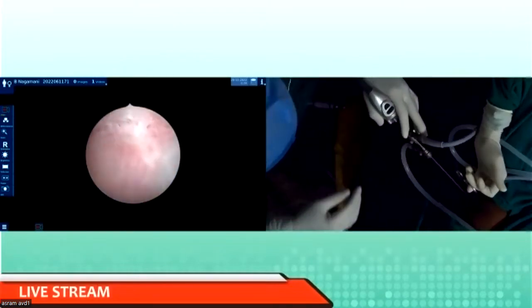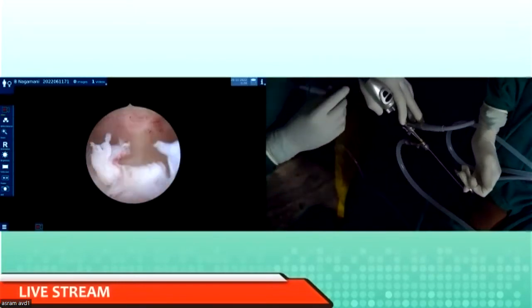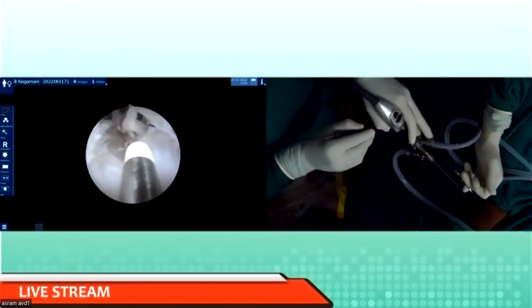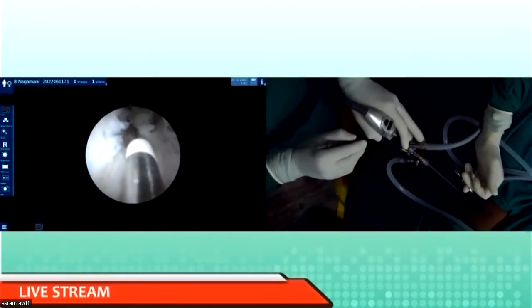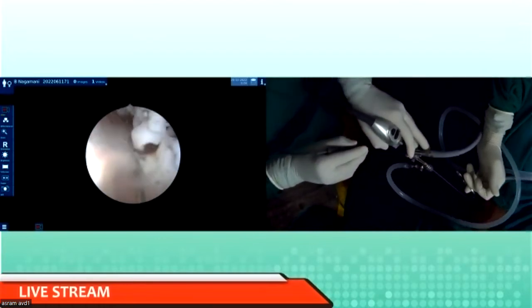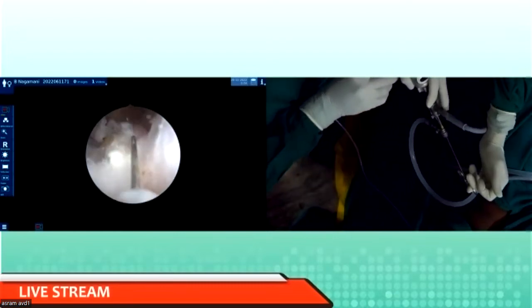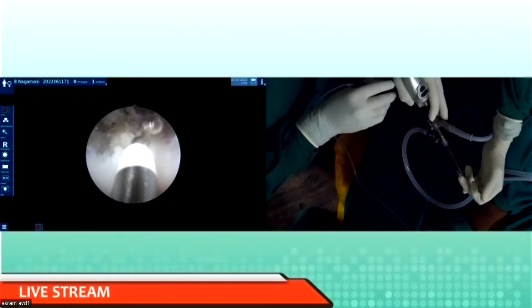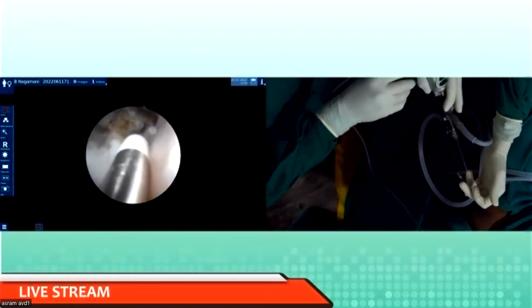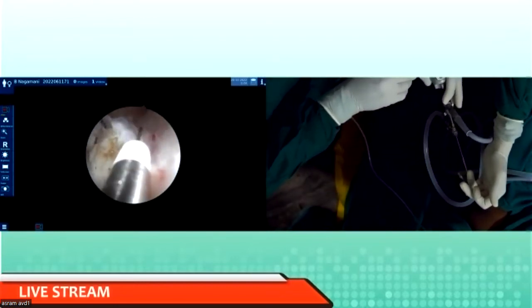Now, foot pedal. So you can also take it like with a cautery like that. Look at that. See, the entire assembly moves, and you can take the biopsy like that. Okay, sir. Very good. Yeah, bipolar cut this. Okay.